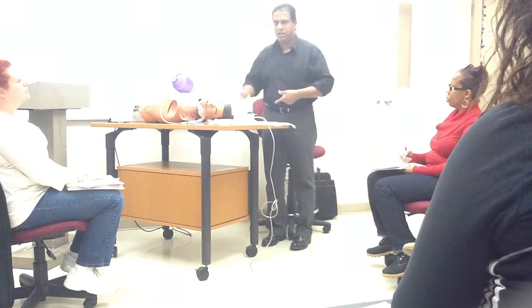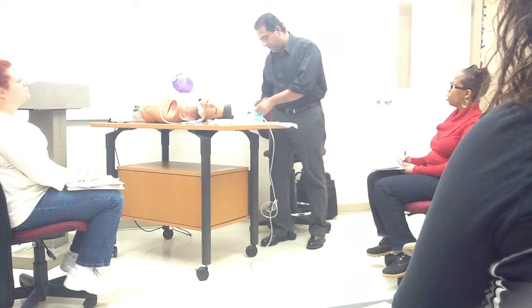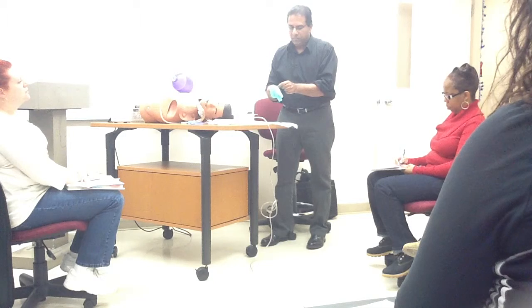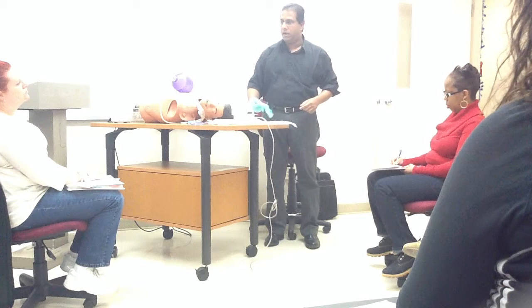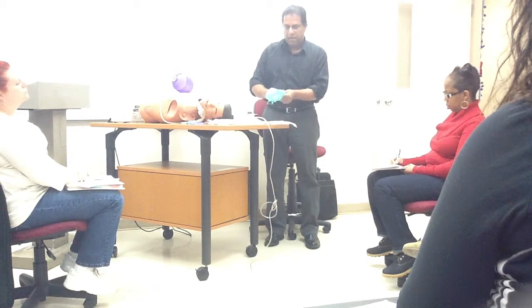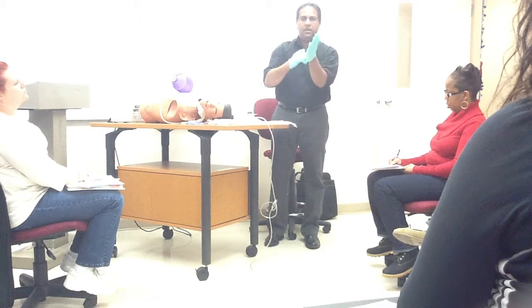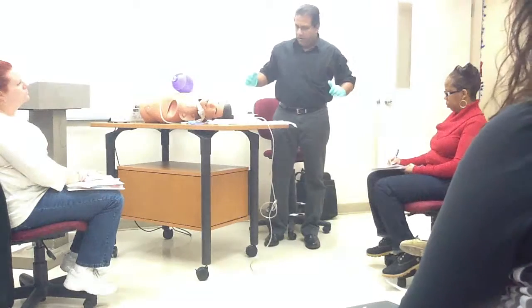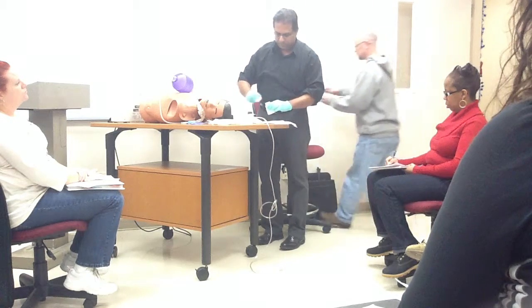How do you put the gloves on? This is not going to go on my hand. This is the aseptic technique. You don't want to touch the outside. It's very small. Just pretend that it's one of these other ones. Well, I got this one on and it's sterile. Now I can touch this glove anywhere I want, but I have to slip my hands inside. You see this? Slide it up, out of the way. All right. Now, take this.